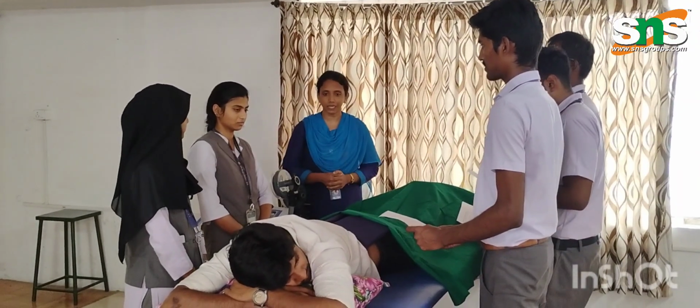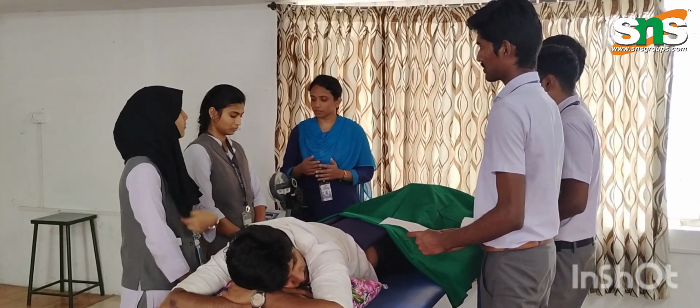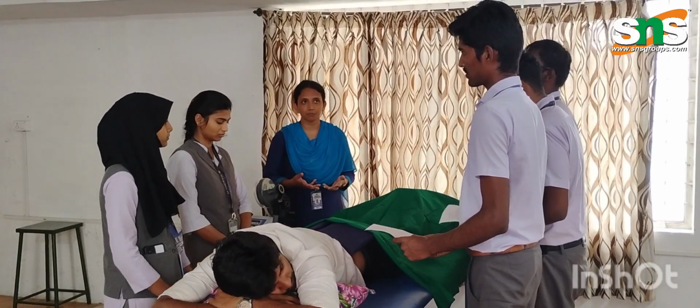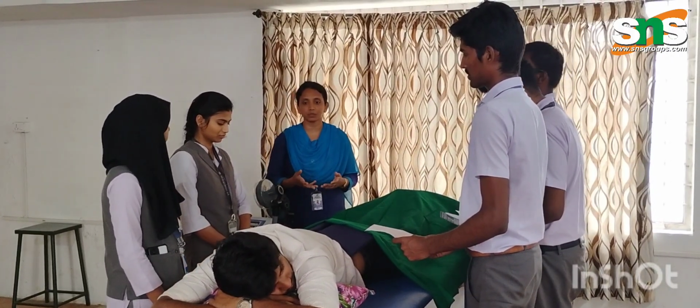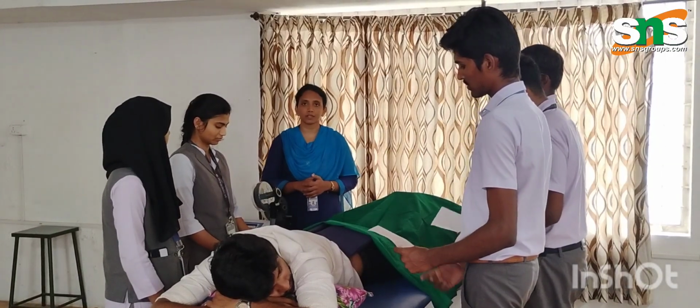Today we are in our clinic. We have a patient with chronic low back pain, and our mentees are going to present a practical aspect of treating the patient with low back pain using an electrotherapy modality called short wave diathermy.